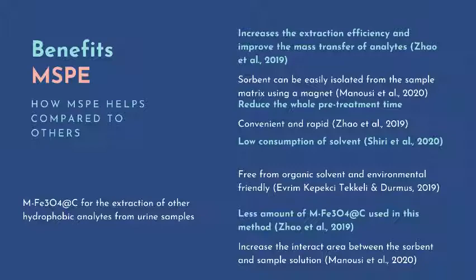Moreover, the sorbent can be easily isolated from the sample matrix using a magnet at the end of extraction, avoiding centrifugation for extractant collecting, thus reducing the pre-treatment time.